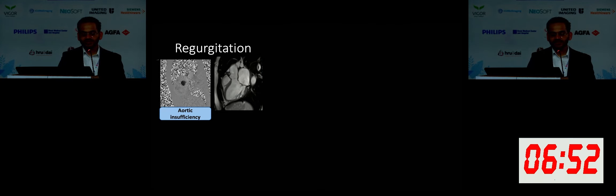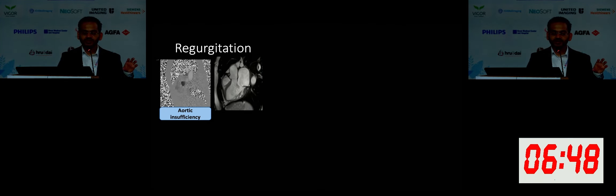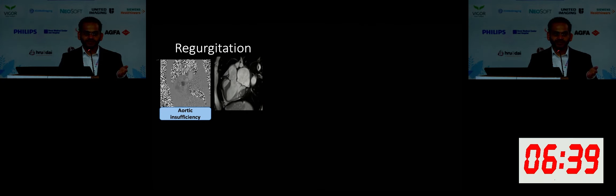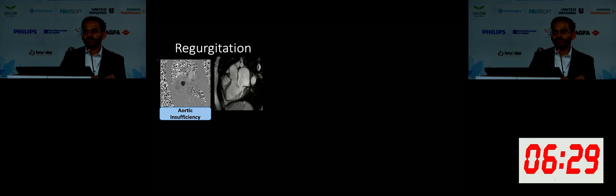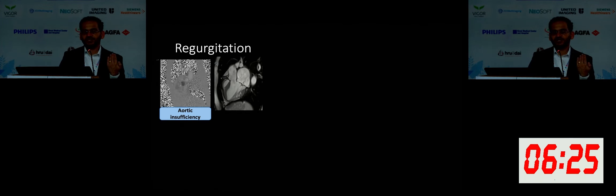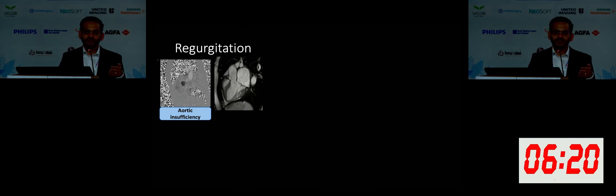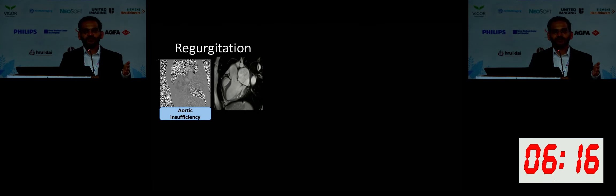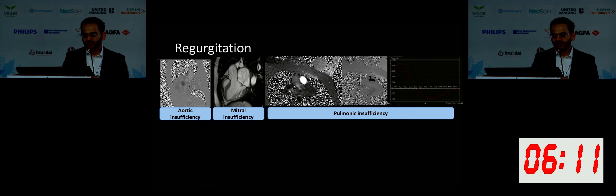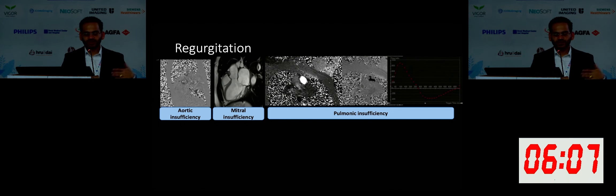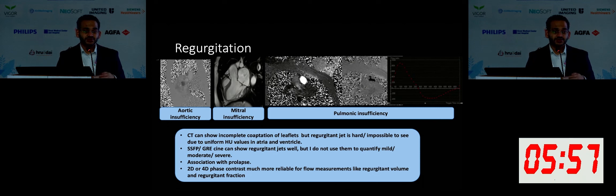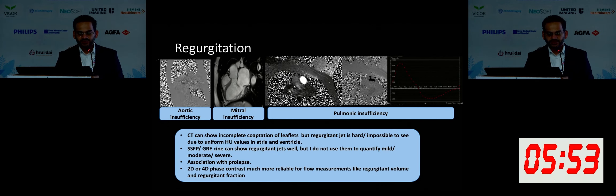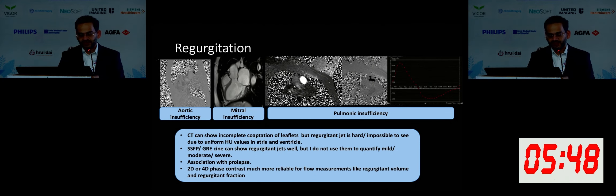With regards to regurgitant lesions, I think when we only look at SSFP or cine images alone, I don't generally quantitate the degree of regurgitation based on cine images alone because you can be terribly wrong doing so. Unless you have a 2D or 4D phase contrast, you can't comment definitively on the degree of regurgitation. I typically tell my fellows not to say mild-moderate on cine images — just say a jet of mitral regurgitation is seen. Then you can calculate the forward flow, backward flow, the regurgitation fraction, and regurgitation volume. Note that regurgitation is sometimes associated with prolapse, particularly in the mitral space.